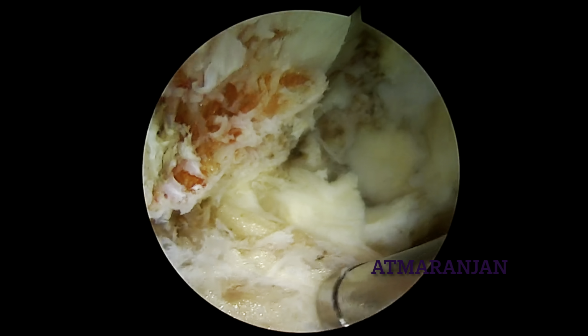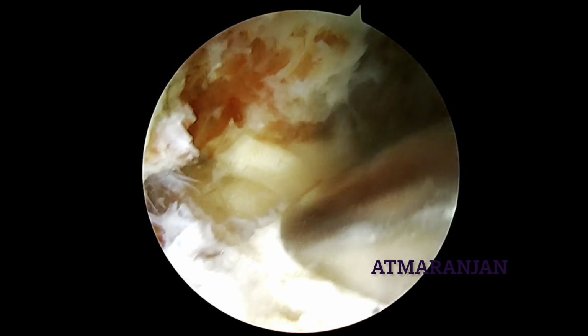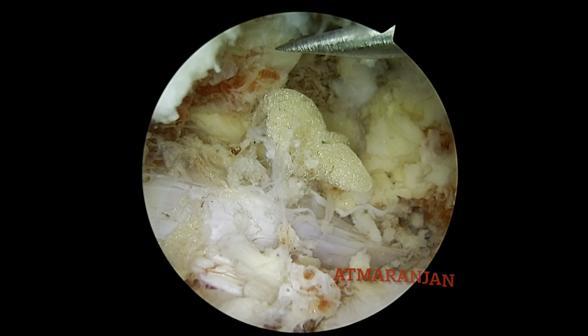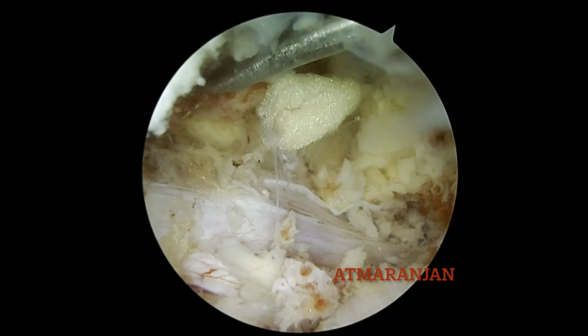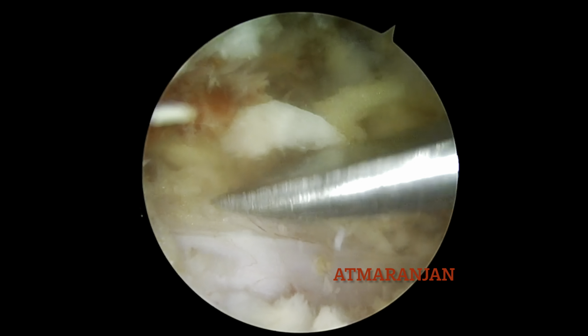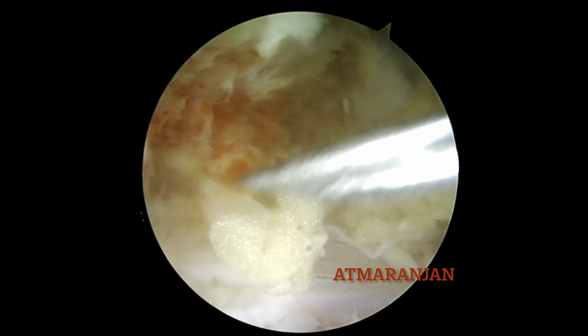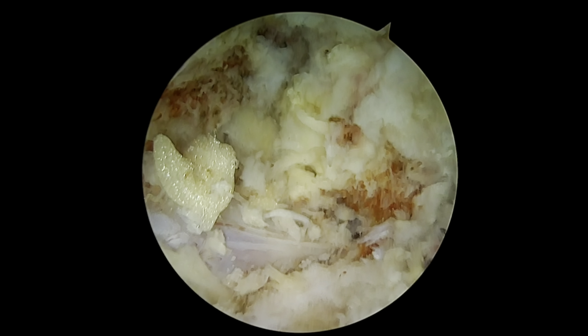This is the contralateral facet I am working on. You can see the mighty hypertrophied facet on bilateral side, and careful trimming of the facet with an osteotome is of paramount importance in making the canal wider. Osteotomes are very handy in biportal endoscopic spine surgery and can be easily introduced to the working port.